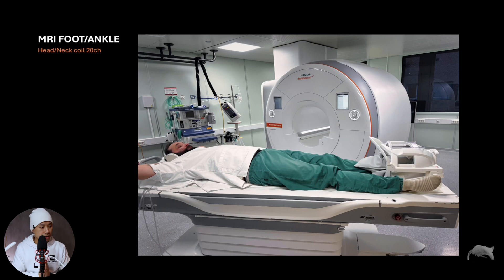We're doing the ankle in the head neck 20-channel coil, as you can see here. My first thought was to have the anterior part positioned like this, with the patient lying on a pillow, as comfortable as possible — the usual routine. I tried to fixate it as well as possible. I noticed that even without the front coil element on it works great, but in this test I did try with and without the front coil, and the images were the same.